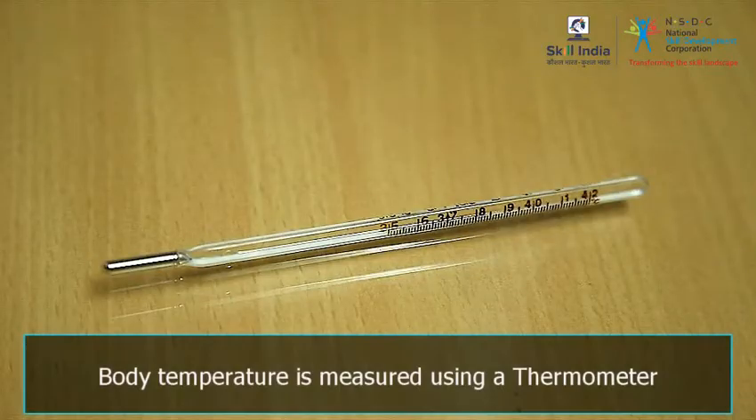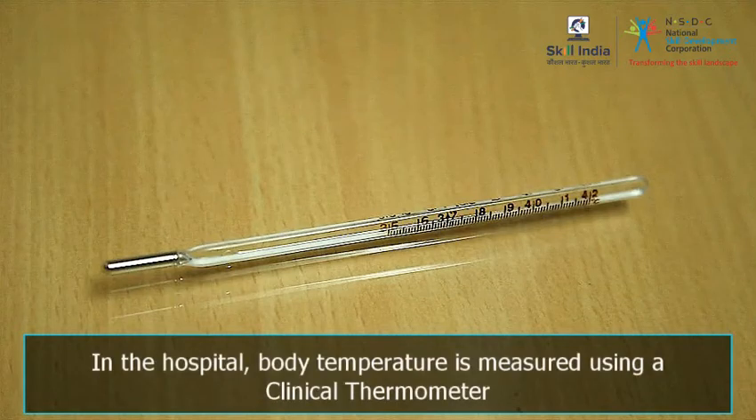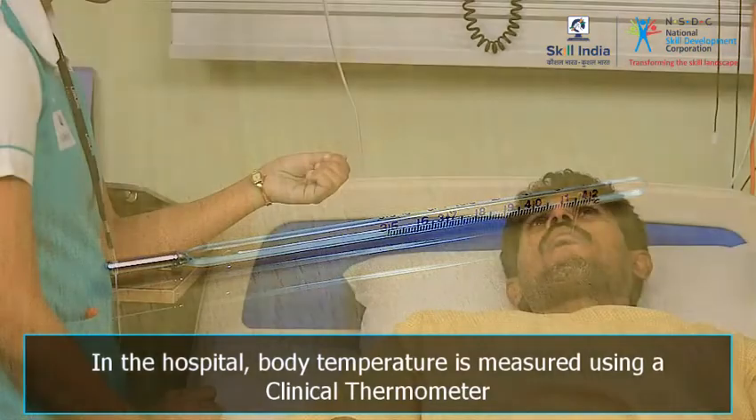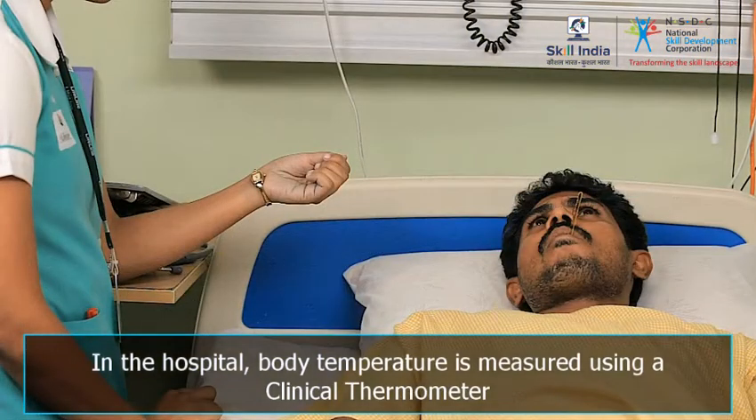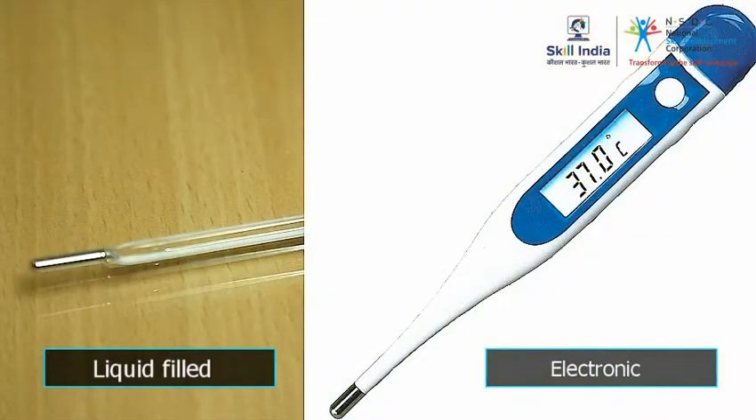Equipment used for measuring body temperature: body temperature is measured using a thermometer. In the hospital, body temperature is measured using a clinical thermometer. Clinical thermometers are of two types: liquid-filled and electronic.